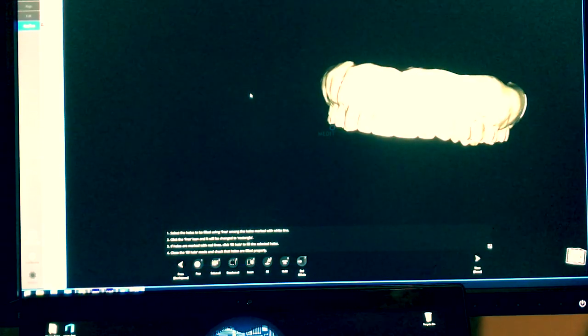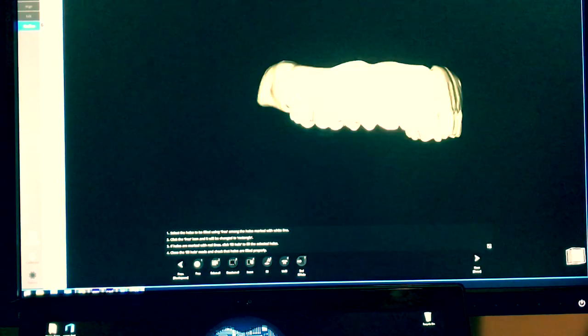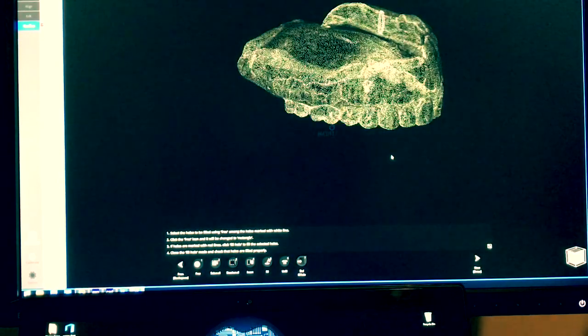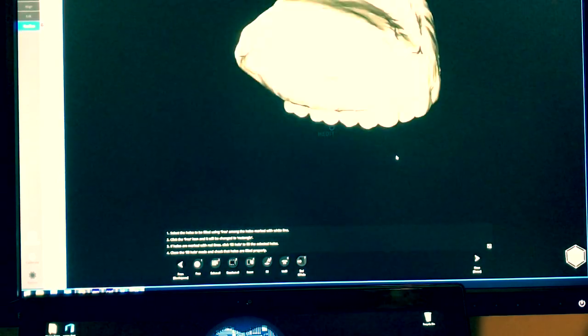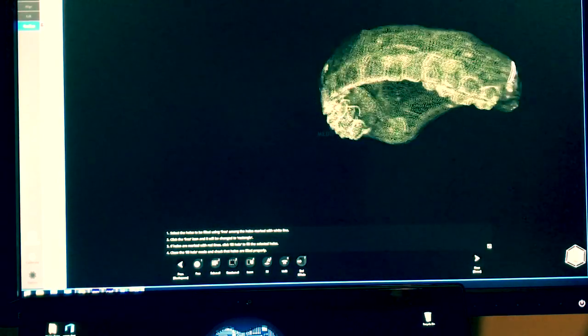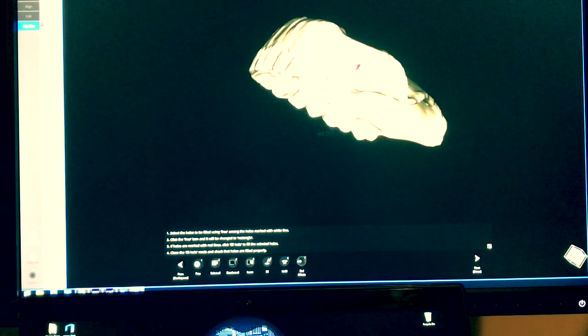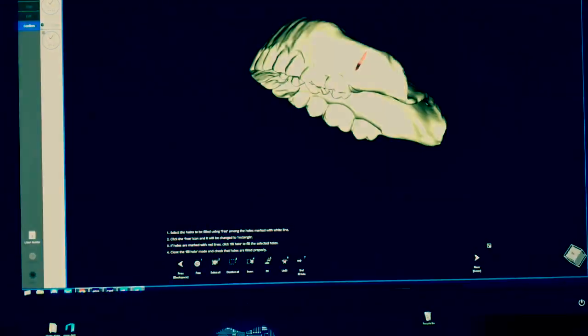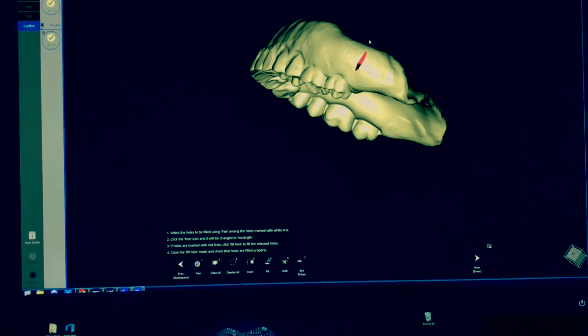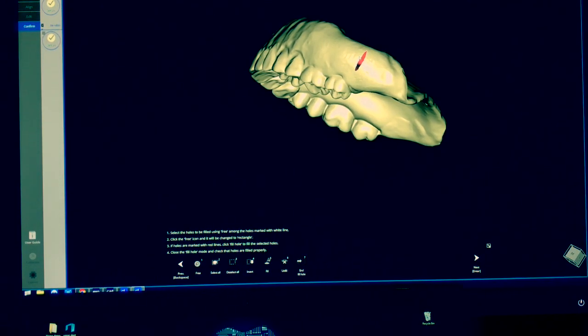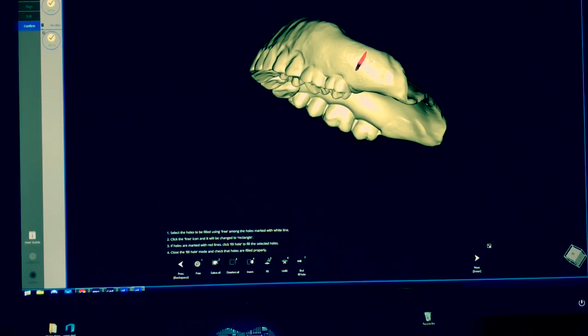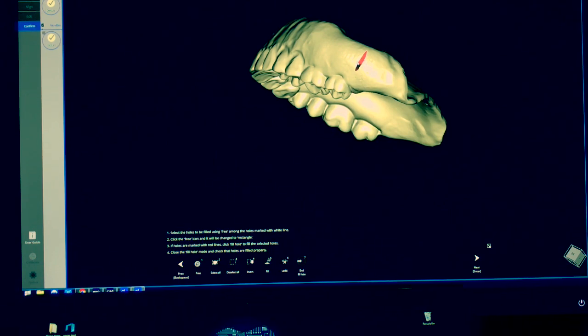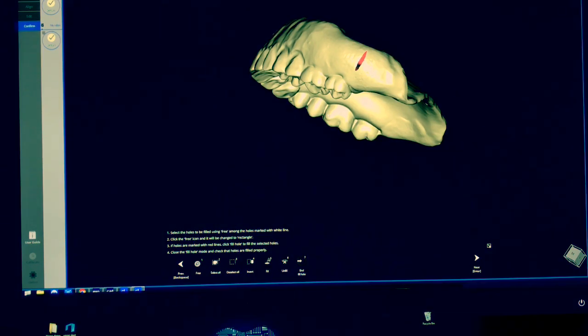Another thing I want to show is that after you duplicate things, every now and then you end up with a little defect. You can see the mesh here is open. Not a big deal to be honest, because I'm just going to use this as a pre-op in my software to be able to modify what I need to modify and then make the final. But in some instances you want to actually close this. Some people have to export it and re-import in software like Meshmixer to repair them.